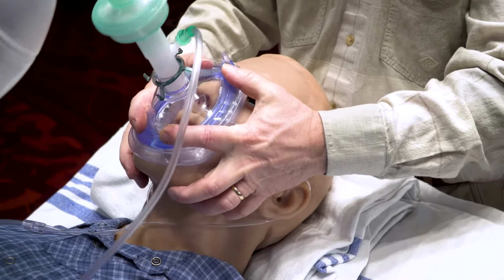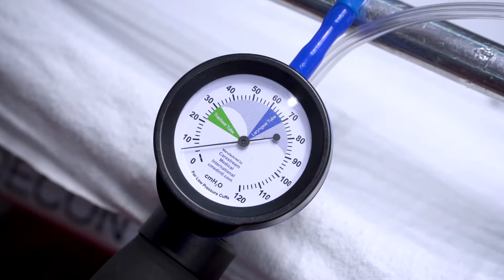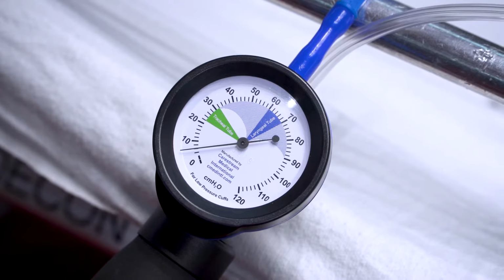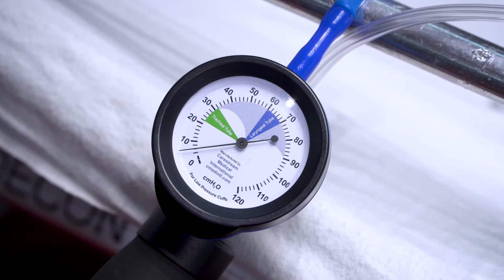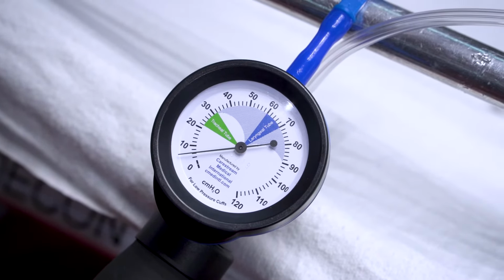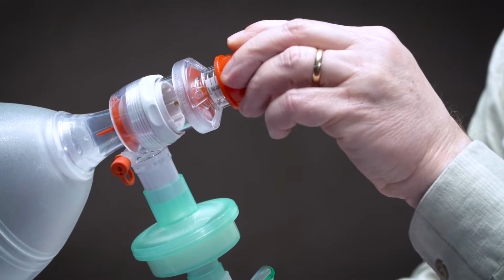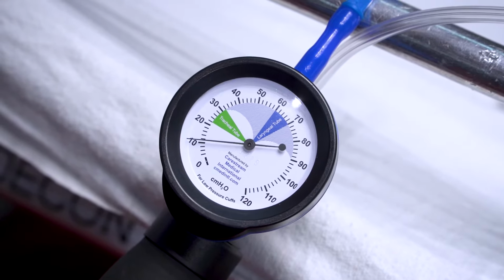And then when I put the bagger on, to close the system, I'm applying a small amount of CPAP there. You can see it on the pressure monitor. So that's, the PEEP valve is set to 5. By holding the mask over his mouth and getting a good seal, I can get a CPAP of 5 with the patient. And if that is not giving him adequate oxygenation, I can actually increase it by turning up the PEEP valve.